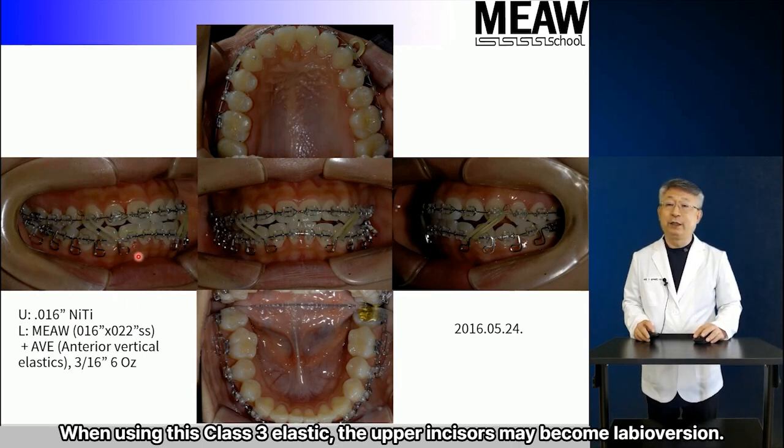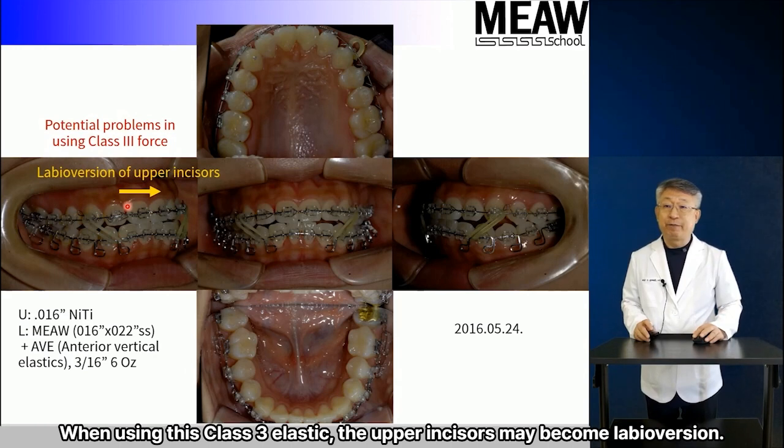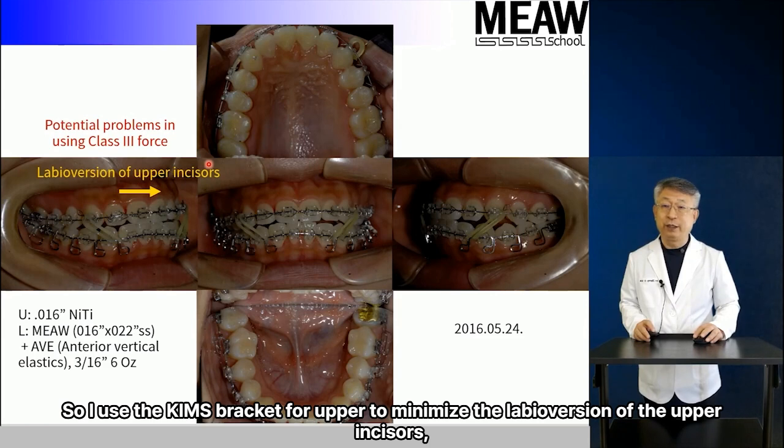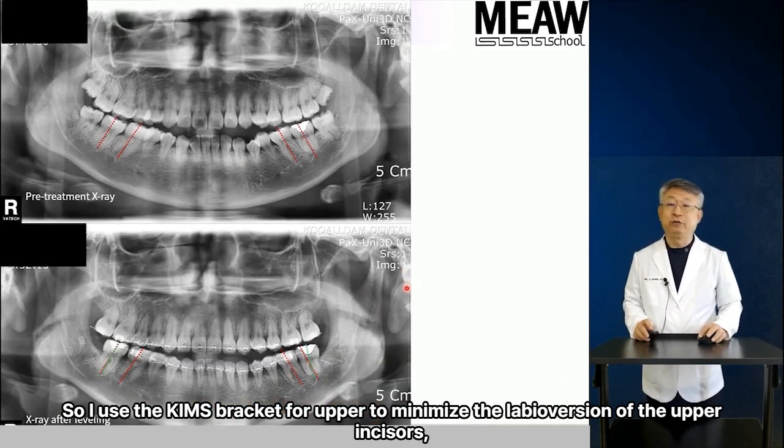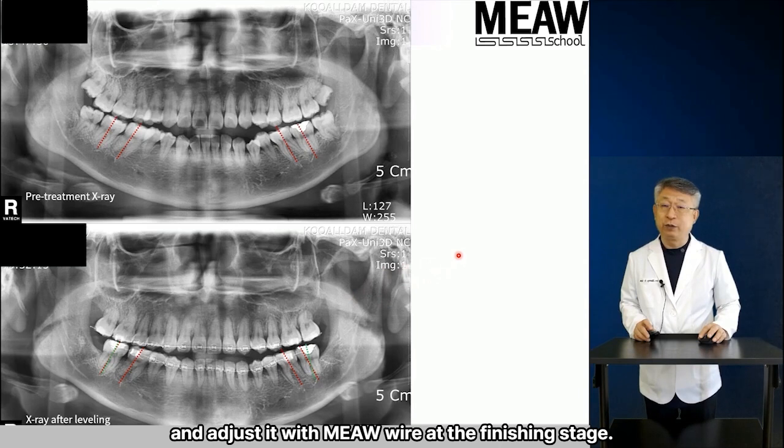When using this Class 3 elastic, the upper incisors may become labioversion. So I use the Kim's bracket for the upper to minimize the labioversion of the upper incisors and adjust it with Meo wire at the finishing stage.